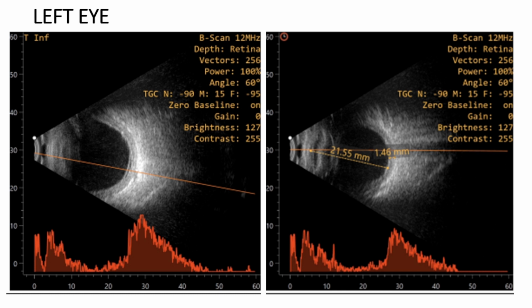I think there's a shallow RD in the left eye too. How will you explain that membrane echo? Probably inferior. On clinical examination there was no retinal detachment noted, but the scan is suggestive. You only put that image. Yes, it is showing a membrane echo. There is a high reflective membranous echo, possibility of shallow retinal detachment with retinochoroidal thickening.